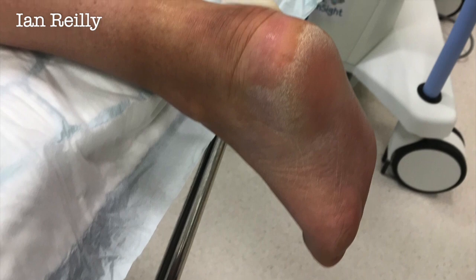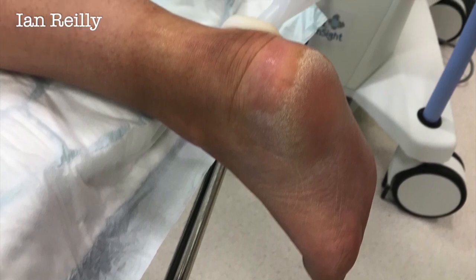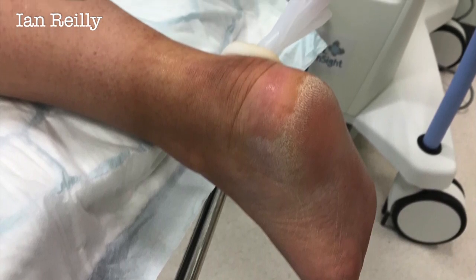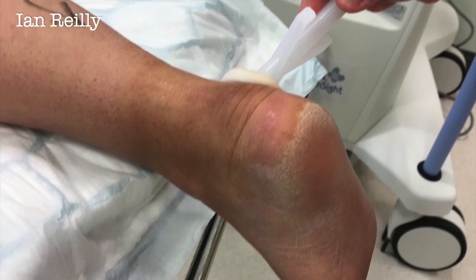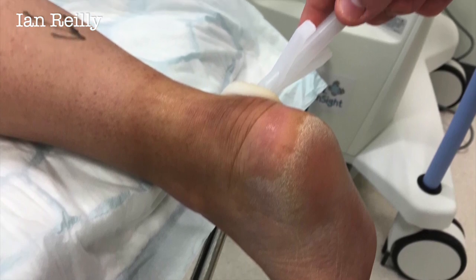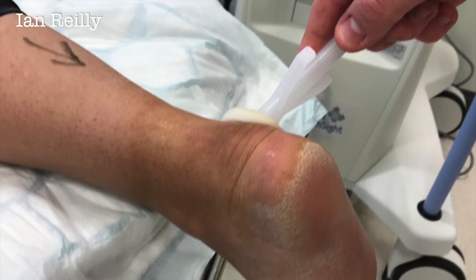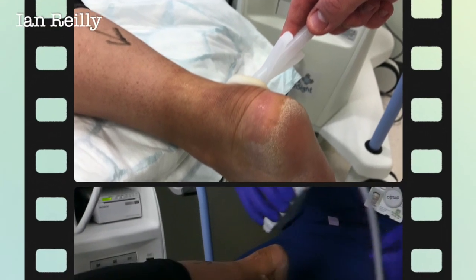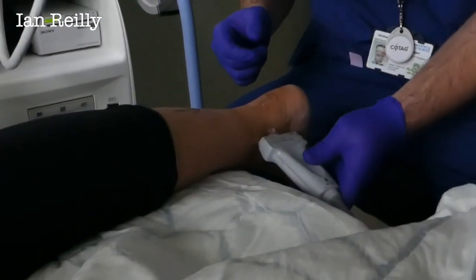Aseptic technique, of course, before any skin injection. Here we're using chloroprep, which is the current chlorhexidine gluconate skin prep of choice, though you could also use iodine. And then you can start.